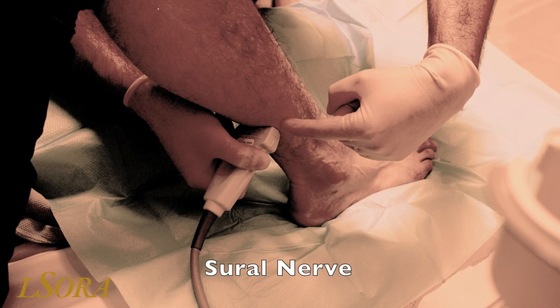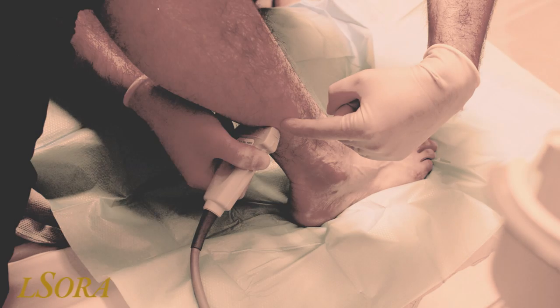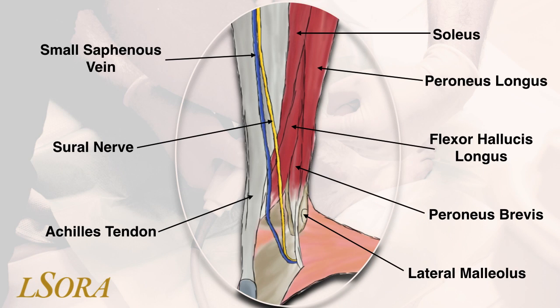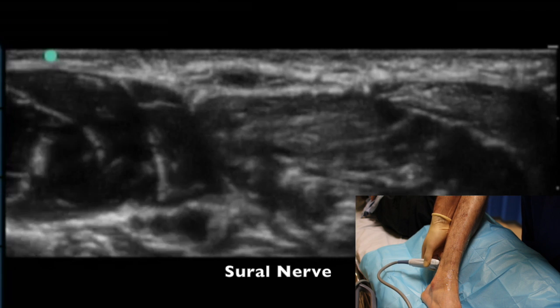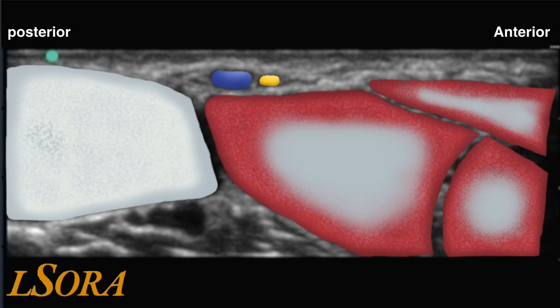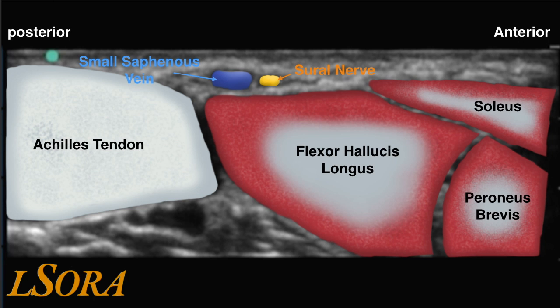Finally, the probe is moved to the posterior aspect of the leg to scan for the sural nerve. Looking at the anatomy of the posterolateral aspect of the ankle, you will identify that the sural nerve lies in close proximity to the small saphenous vein, which is a useful ultrasound landmark. We are also surrounded by the Achilles tendon most posteriorly, the muscles of peroneus longus, peroneus brevis, and flexor hallucis longus. To scan for the sural nerve, the probe is placed at the posterolateral aspect of the ankle. Once the Achilles tendon has been identified, ensure that you identify the small saphenous vein, as the sural nerve will lie in close proximity to it.